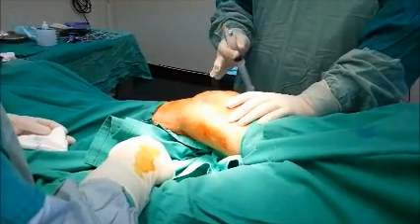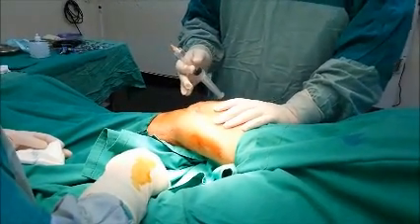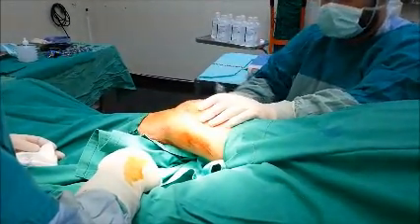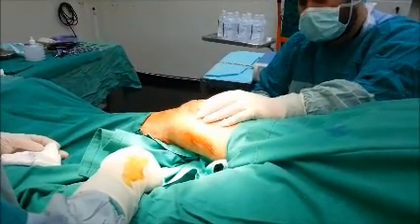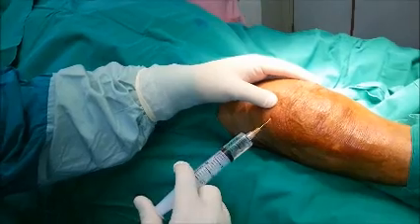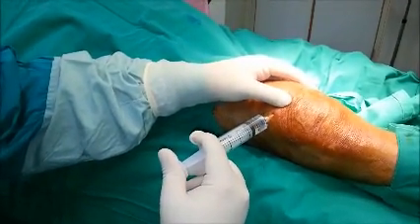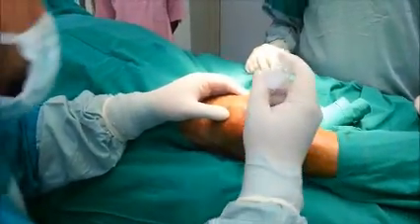This is a technique for lavage of septic arthritis of the knee in a frail patient who cannot tolerate general anesthesia or arthroscopic synovectomy and debridement. This is the local anesthesia applied to the suprapatellar pouch — here is the patella — and now anesthesia on the other side.